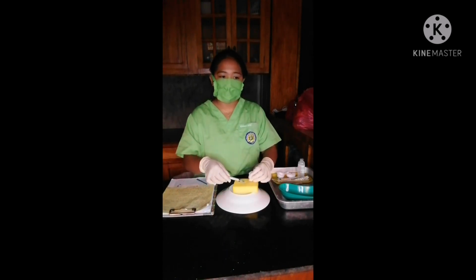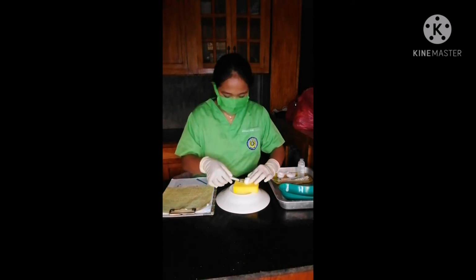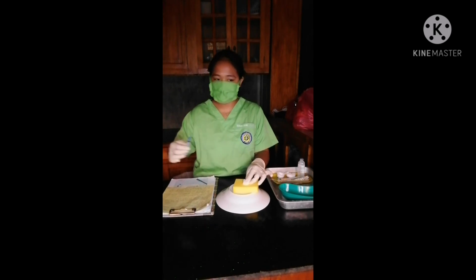Using a gauze square, apply gentle pressure to the site after the needle is withdrawn. Do not massage the site. Do not recap the used needle. Engage the safety shield or needle guard if present. Discard the needle and syringe in the appropriate receptacle.